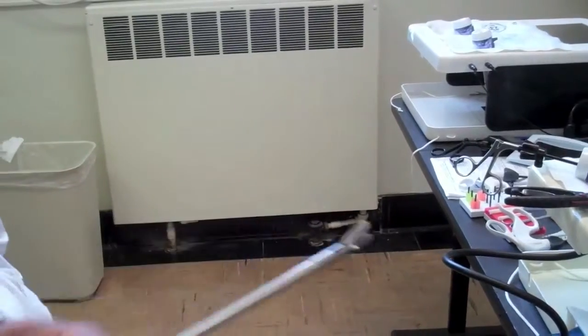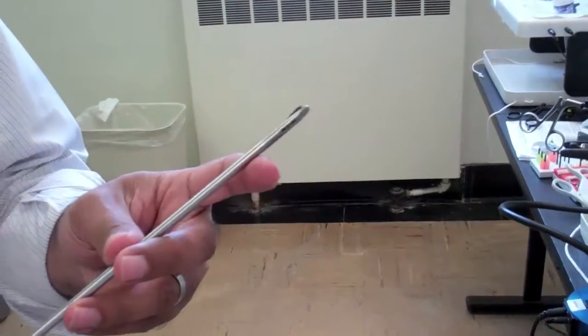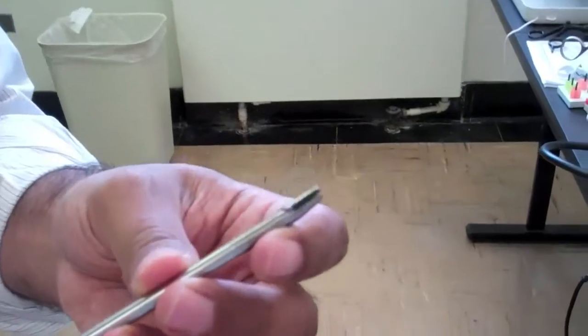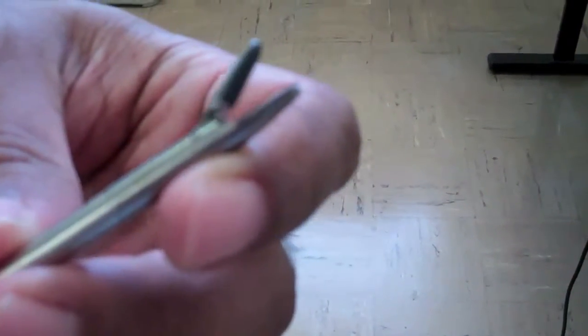Okay, so the first thing is to get to know your needle driver. We have two styles of needle drivers here in the lab, but the basic thing is that the bottom blade should always be static. You see the bottom blade here doesn't move. The top blade goes up and down as you pull the trigger. The other thing to look at is the locking mechanism.